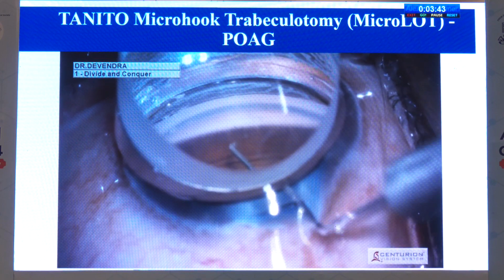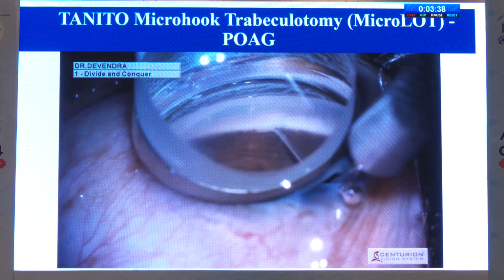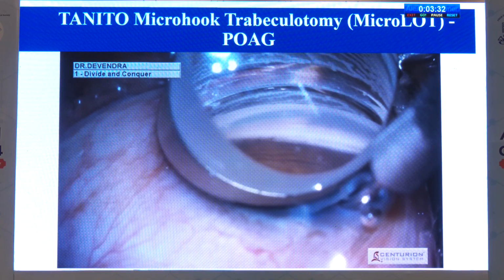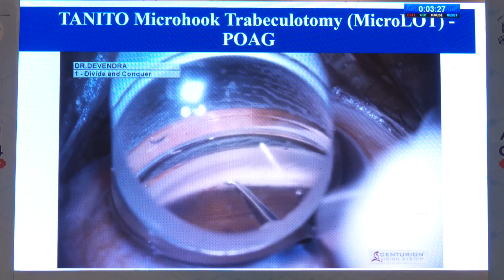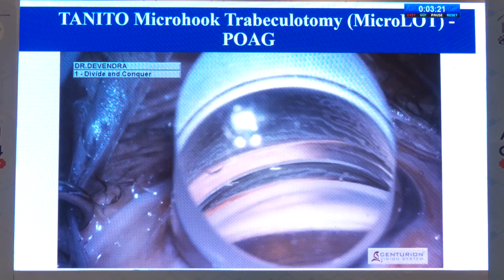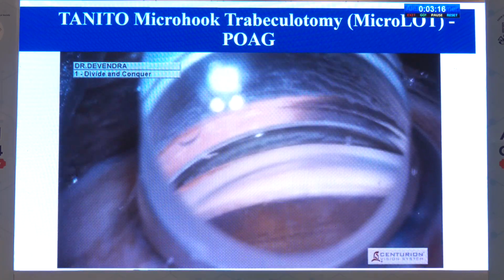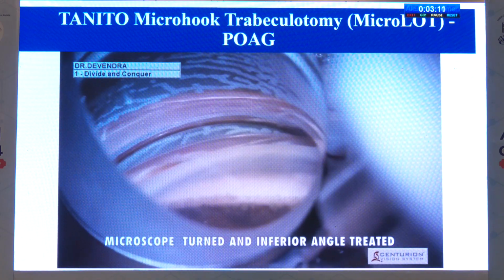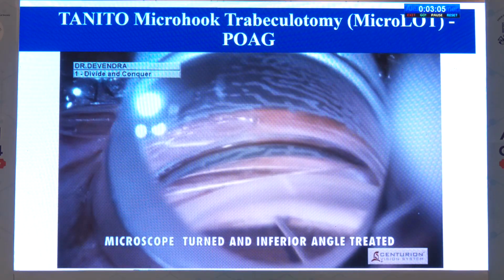This is again a similar way, after phacoemulsification, use the Swan Jacob gonio lens as Dr. Amit already told, and just incise the trabecular meshwork. With the left hand side you can incise the inferior angle, then again come to the right hand side. Similarly, and you can see this right now is the white snow-like structure. Again, if you want to do more goniotomy, you can turn the patient's head inferiorly, or you can work on the other side.